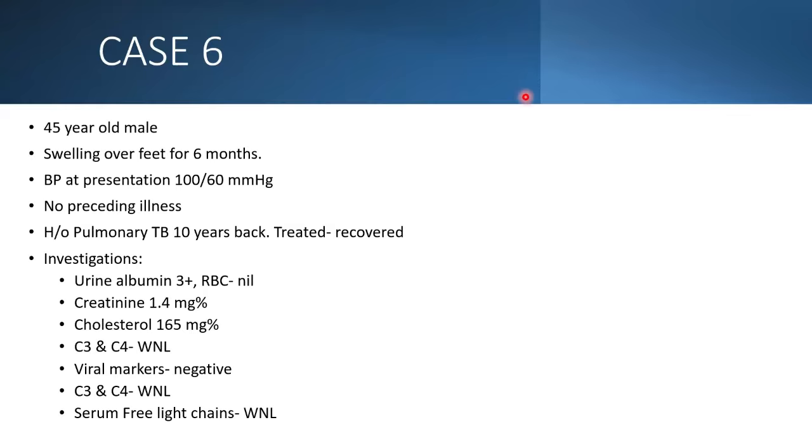That you already told, just you can highlight. So I talked about the MPGN, so you have to subclassify. So even if you are having a conventional immune complex MPGN with IgG, C3, C1q, you need to figure out what those complexes are. They could even be having some substructure there.